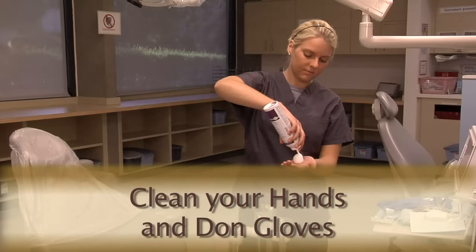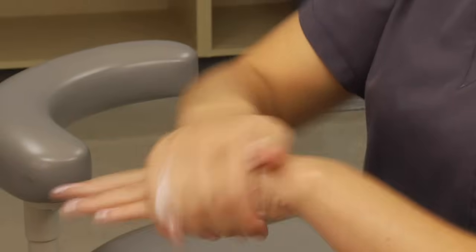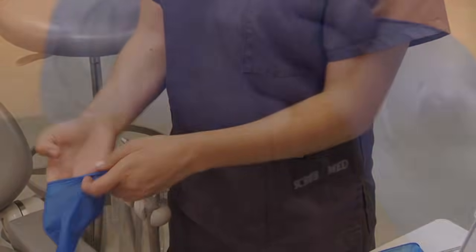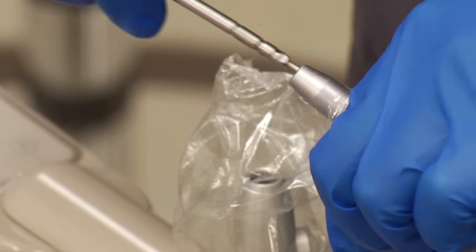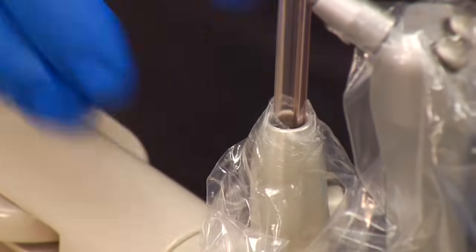Next, wash your hands or use alcohol rub to clean your hands. Don gloves. Place air water tips into the syringes and suction tips onto the suction hose connectors.